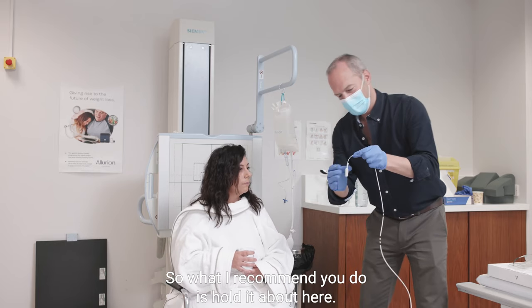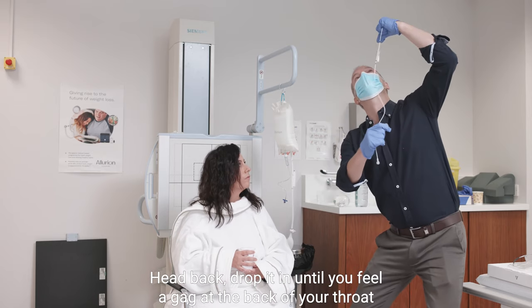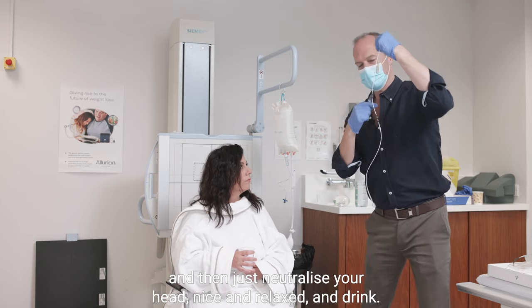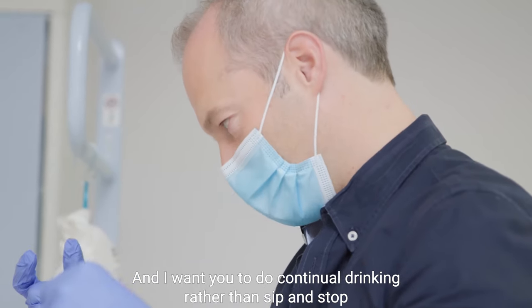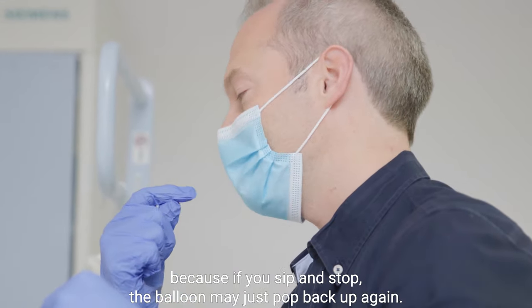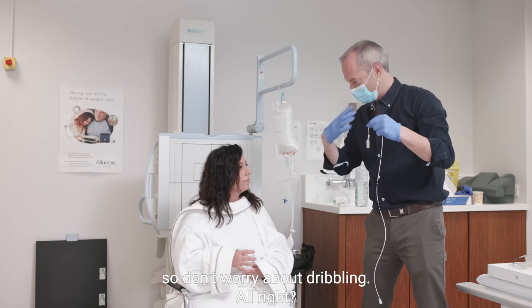What I recommend you do is hold it about here, head back, drop it in until you feel a gag at the back of your throat, and then just neutralize your head nice and relaxed and drink. I want you to do continual drinking rather than sip and stop, because if you sip and stop the balloon may just pop back up again. So just keep drinking — and that's why we have the gown on, so don't worry about dribbling.